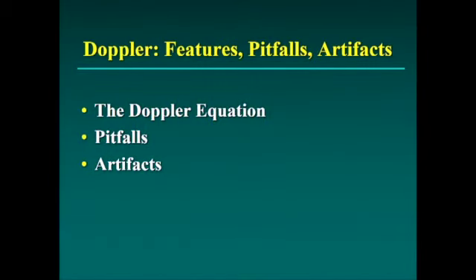So we'll start this off. What I'm going to talk about here is a little bit about the Doppler equation, because this is central to understanding the Doppler work that we do. Then a little bit about some pitfalls, and then a couple of artifacts that arise when you use color power Doppler.